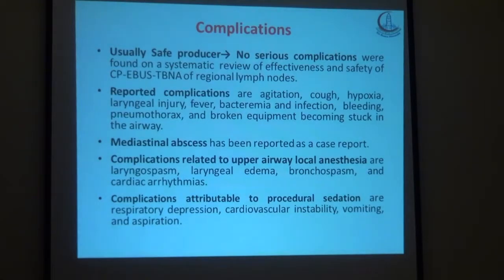الكومبليكيشنز طبعا اللي بتحصل، يعني هو يوجوالي سيف بروسيدر، مفيش سيريس كومبليكيشن صراحه بتحصل، لكن يعني ريبورتد كومبليكيشن بتحصل، طبعا نتيجه ممكن اجيتيشن، هايبوكسيميا، لارنجيال انجري، فيفر، بكتيريميا، انفكشن، بليدنج، نيموثوراكس، طبعا مش يعني حاجات نادره ان حته من النيدل دي تتكسر فتبقى بروكن.